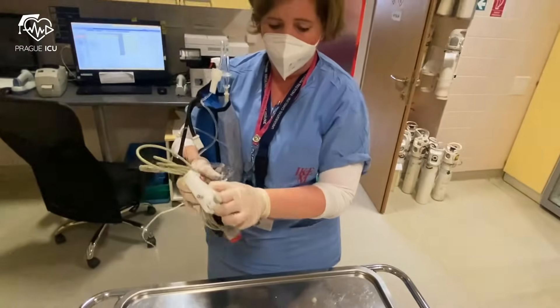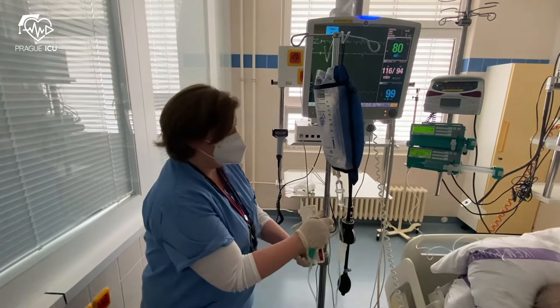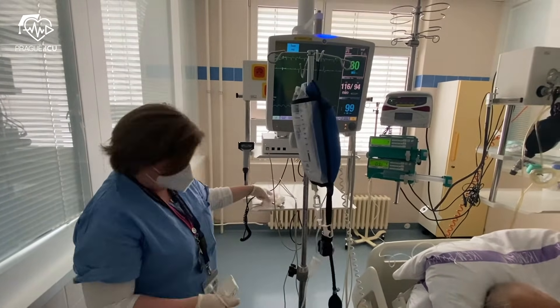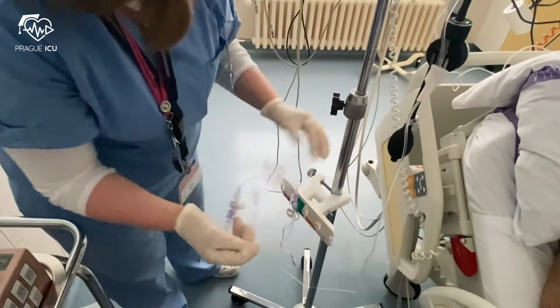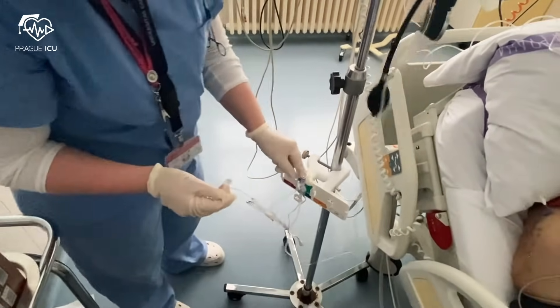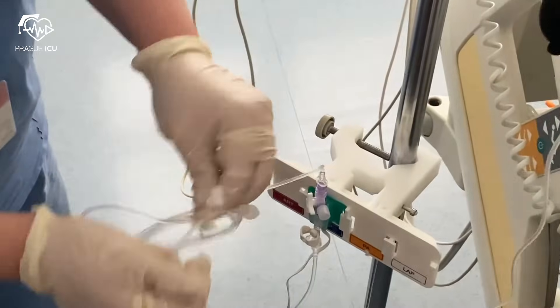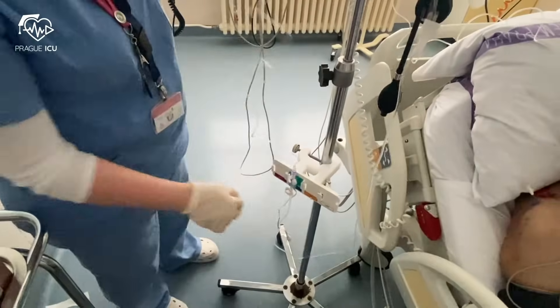Now you can see I'm taking everything to the bedside. At the bedside, you set the transducer into its holder fixed on the IV pole. You need to make sure that the tubing going to the patient is facing upwards, and the cable for the transducer is facing downwards. Again, you can flush the catheter to allow any air to come out of the system.